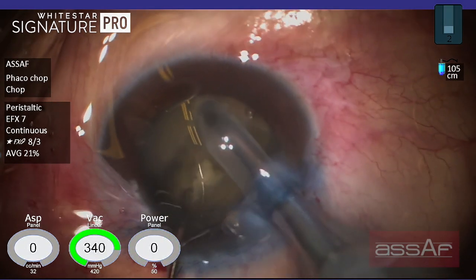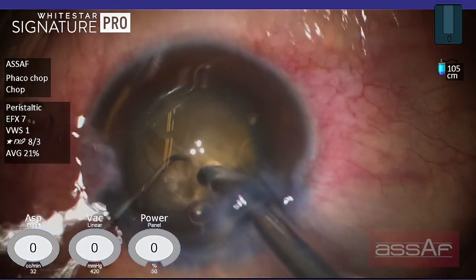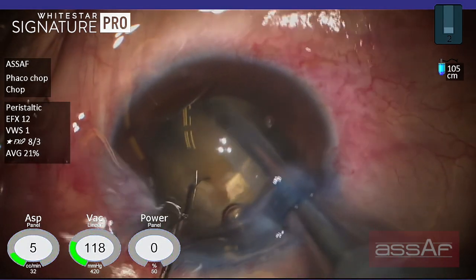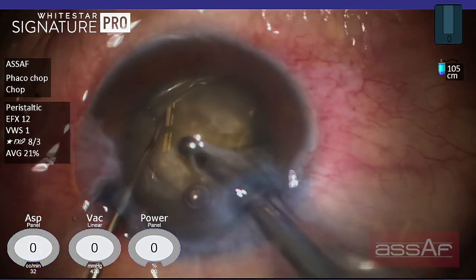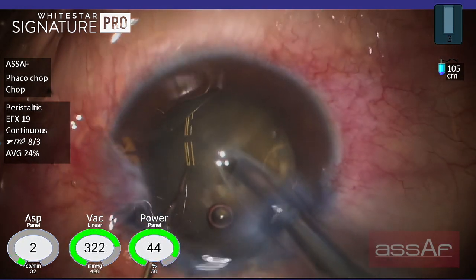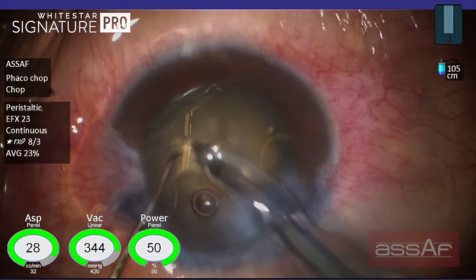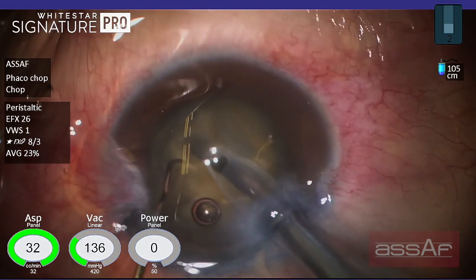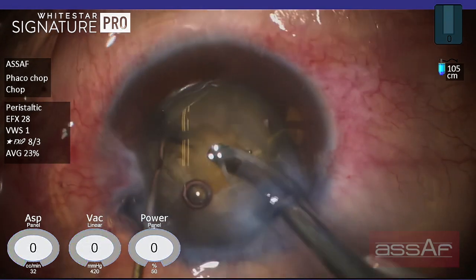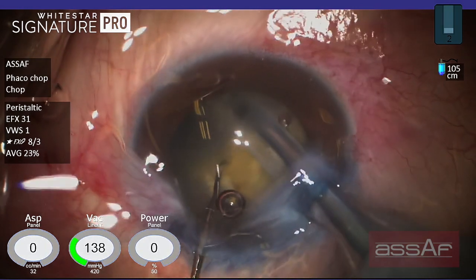Trying to mechanically disassemble this nucleus by the vertical chopper in the left hand. As you can see, the nucleus is still not completely separated into two halves — the two halves are still connected together. Trying to give it another try from another location; again those two halves are still connected. Trying now to divide this part of the nucleus into smaller pieces, but again those pieces are still connected together by the posterior isthmus.